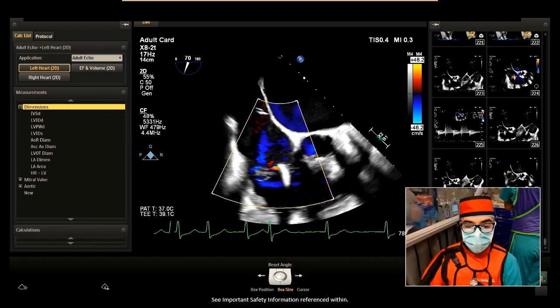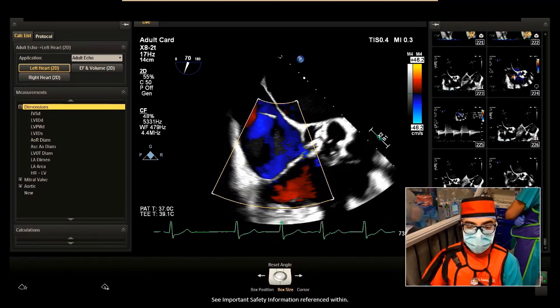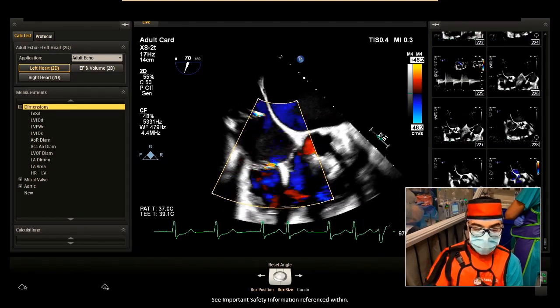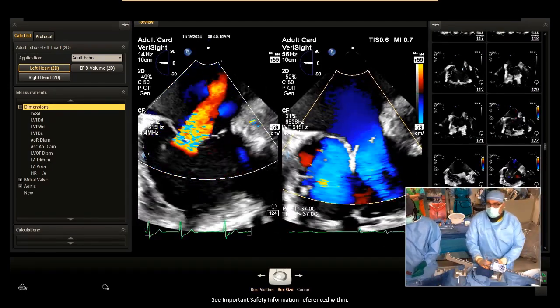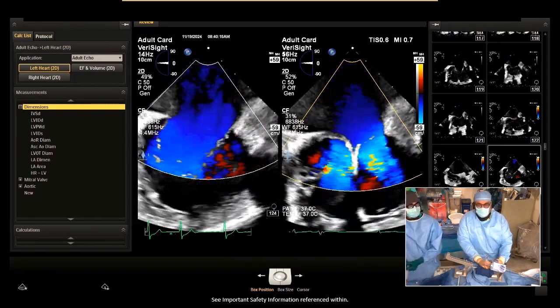Yeah. Get your aspirin. Beautiful. And it doesn't really go back very far. I'll give you that. No. So I think that the location of this clip would be really nice. And then, so what we'll do is we'll close maybe on 3D ICE to do a color compare. Yeah, beautiful. So, all right, so we'll finish off, kind of provide some closing comments here.